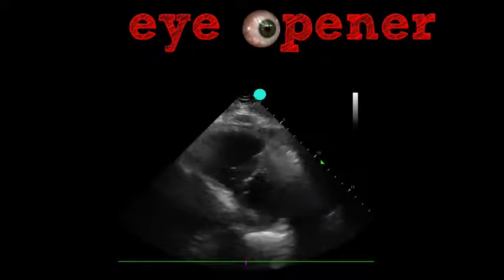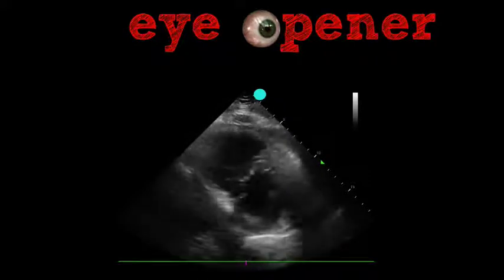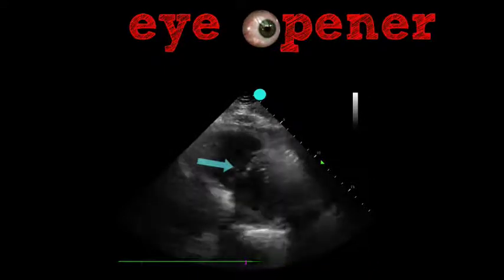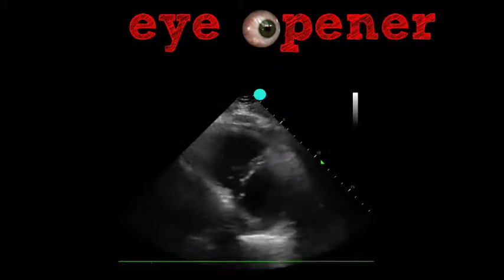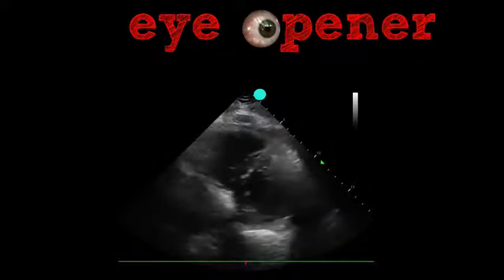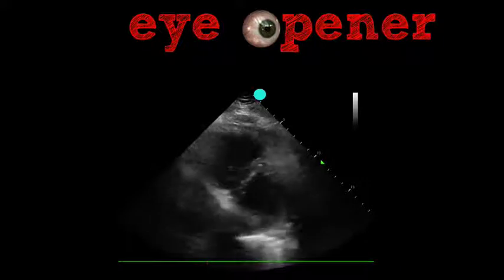So we rotate that probe 90 degrees clockwise and see the short axis view of that left ventricle, and notice, yeah, indeed, that septum really seems to bow into the left ventricle and flatten out, making that D-shaped septum during diastole. Really here, it kind of rounds out during systole. So that tells us that the pressures in that right ventricle during diastole seem to be higher than the pressures in the left ventricle. Now what's causing that, we don't know yet.